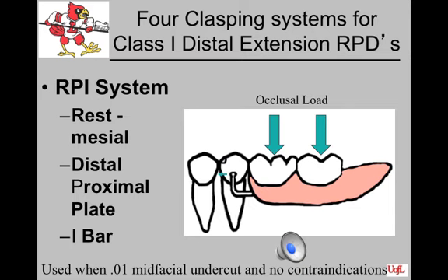as an I-bar recipient. Usually, you can cut a 0.01 undercut into the tooth in order to create that little undercut for retention. But in some instances, if it's really thin enamel and it's really, really close to the gingiva, it makes it difficult to make that transition.